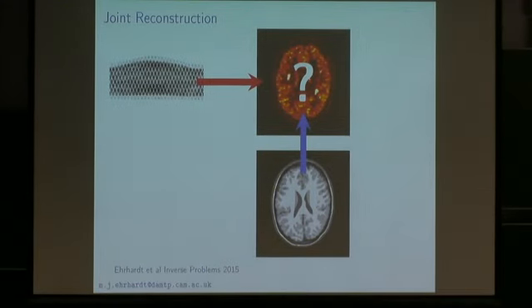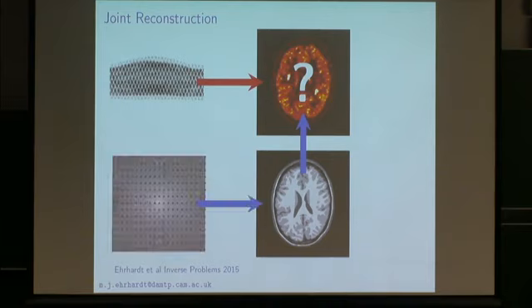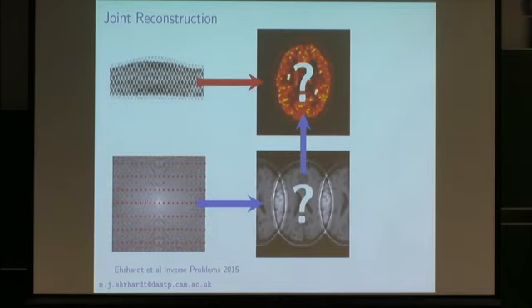So this was the story before: we had our PET data and we wanted to use the MR to enhance the PET reconstruction. But actually the MR scanner doesn't acquire this image directly, but it acquires data from which we can reconstruct the MR. But for instance, if you do undersampling in MR or there's some motion that happened or whatever, then we have a problem of reconstructing the MR. So directly using this information to reconstruct the PET is probably not a good idea.